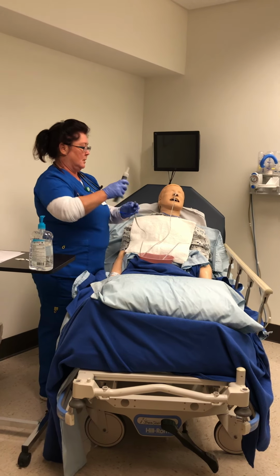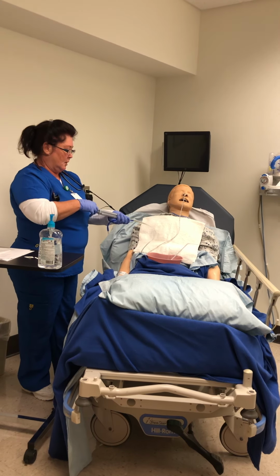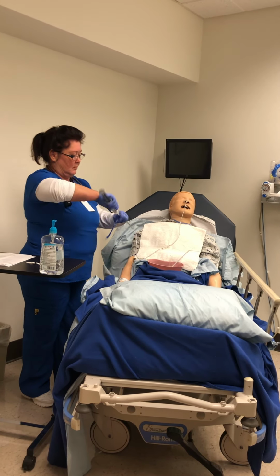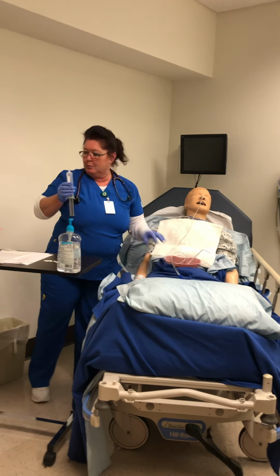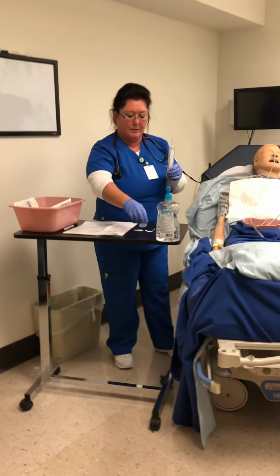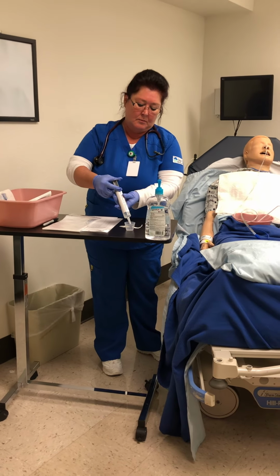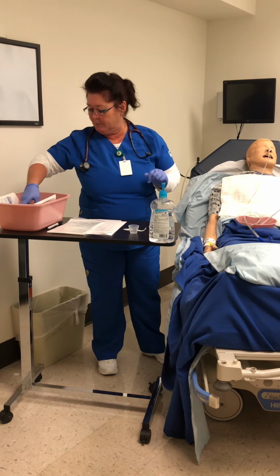So I'm going to unplug, and I'm going to draw. I'm going to plug that back up, and I'm going to put this in the medicine cup. And then I'm going to put this in the biohazard bag.